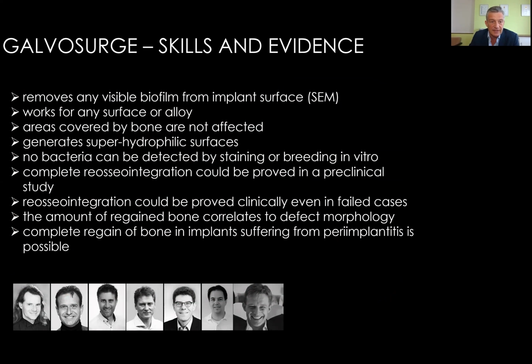To summarize that, I guess we proved for the first time worldwide that a complete regain of bone clinically in implants is possible. And also on 3 cases now, but soon on 4 cases, we proved that we have a re-osseointegration even in implants which failed after therapy and we had to remove.